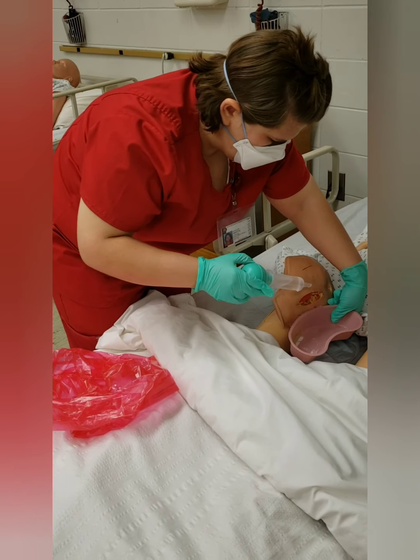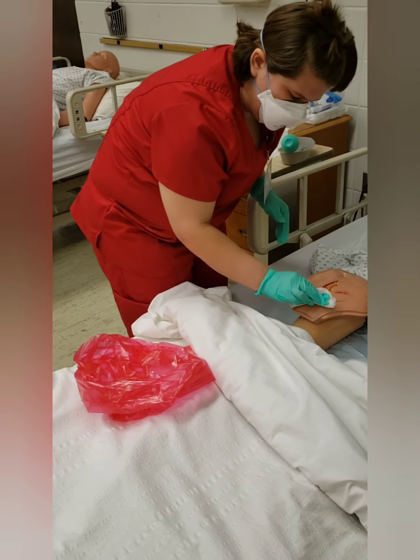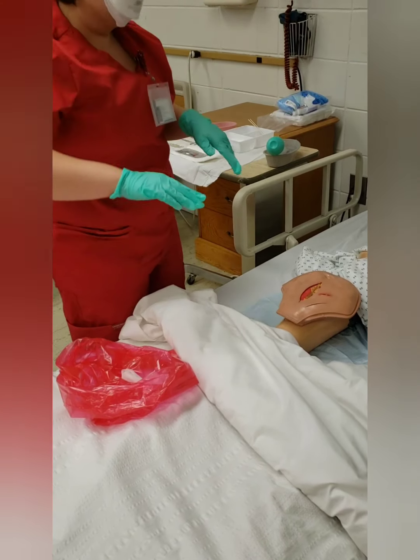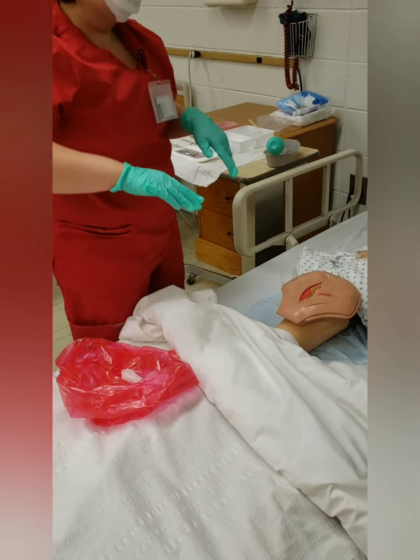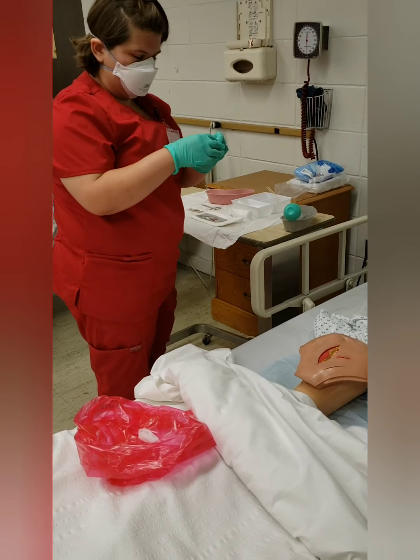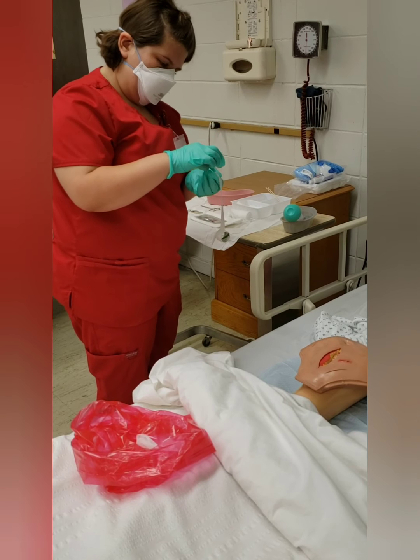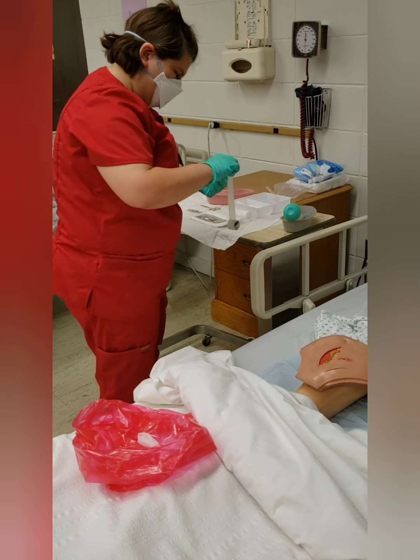We are now going to get some new gauze and dab the wound dry very gently. Then I'm going to wash my hands and change gloves again. Now we're going to get the tape ready for our new bandage.